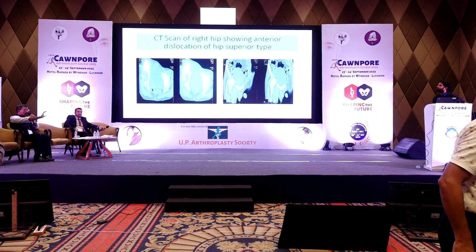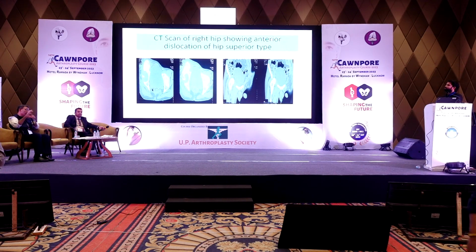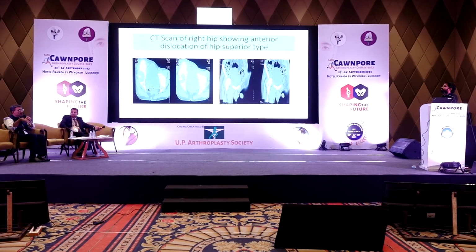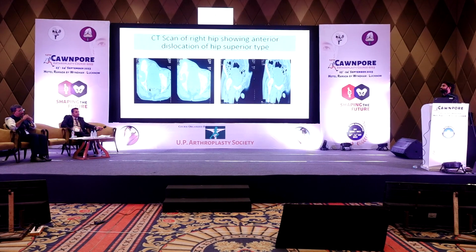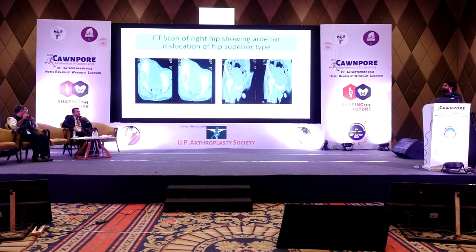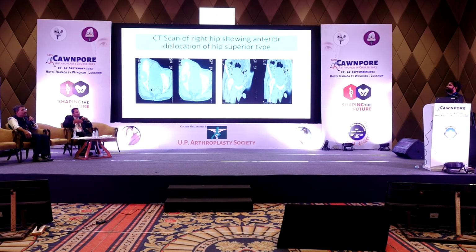Ultimately, when you're dealing with an anterior dislocation, whether it's a pubic type or an obturator type, the soft tissues that are involved are almost identical. So the release is required more anteriorly. And remember, the iliofemoral ligament is gone. Yes, sir. So once you have dealt with all the releases, the reduction shouldn't be a problem. It's a good execution, and the plan was done. If you're doing it in acute, THR, if needed, can be done in the second stage rather than going in for a Girdlestone initially. Yes, sir. That should be the message.